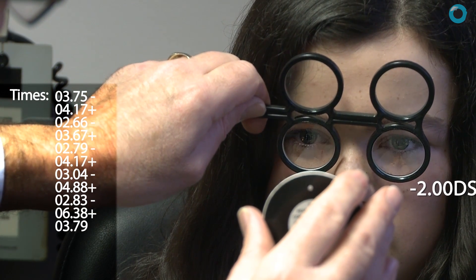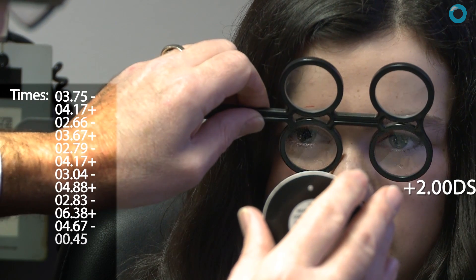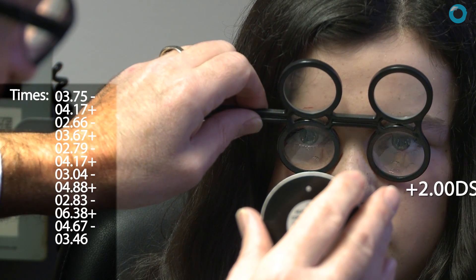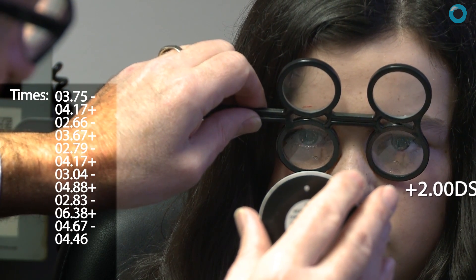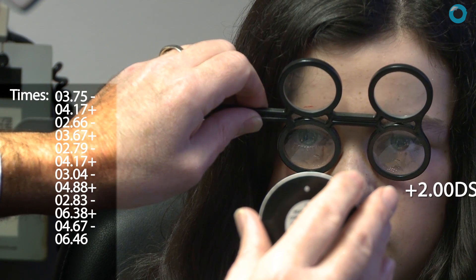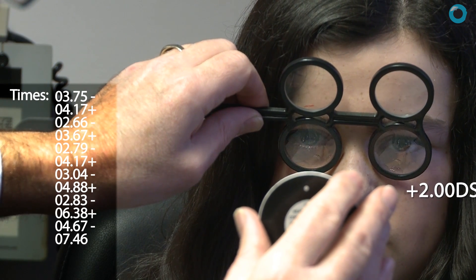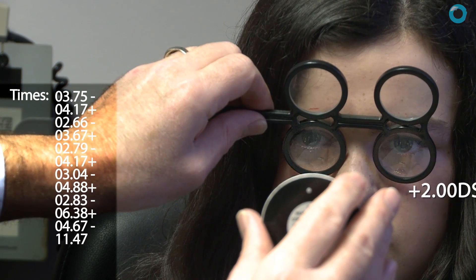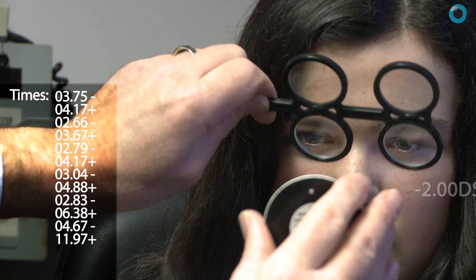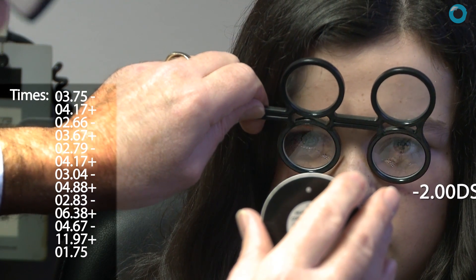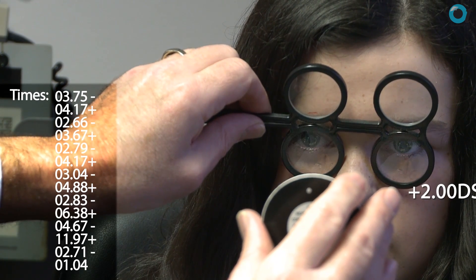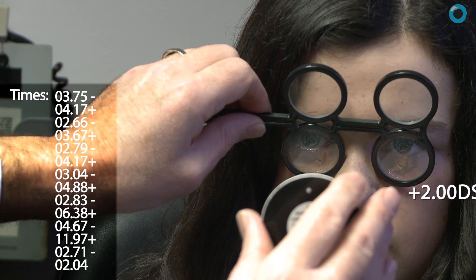If a patient can't manage to stimulate two diopters of accommodation, they have an insufficiency. But if they can't relax and see through the plus two lens, that's suggestive of over-accommodation — an inability to relax accommodation. You must also ensure the refraction is correct and rule out latent hyperopia.